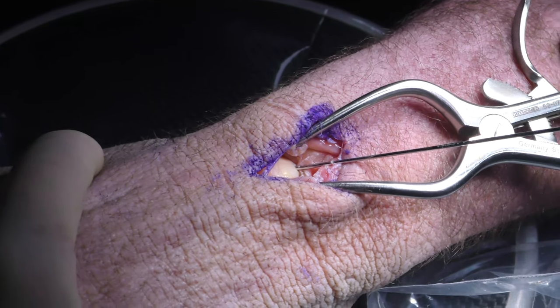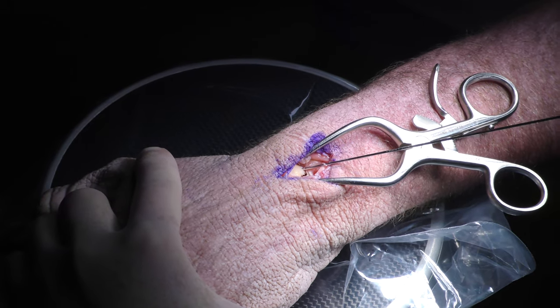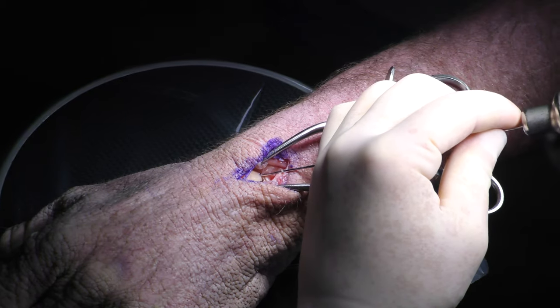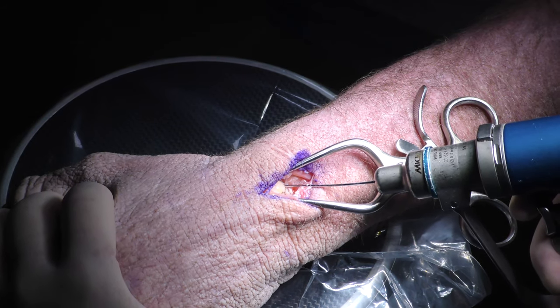And so at this point, you've made your measurement, and one of the things that happens with cannulated screws, and it can be a difficult thing, is that the wire will come out. It might come out, but one of the things you can do is purposely put it into the trapezium. That won't hurt the STT joint at all.